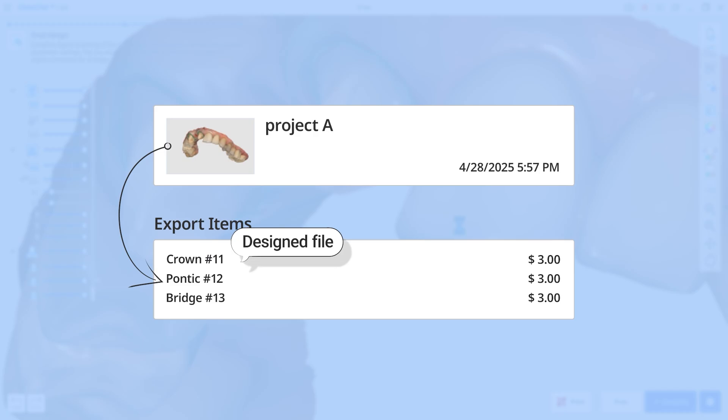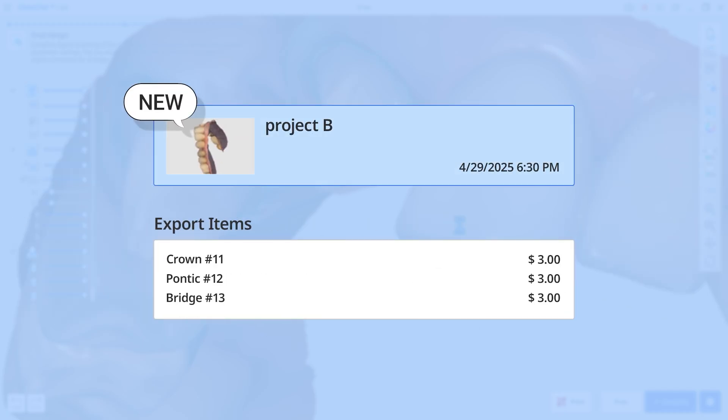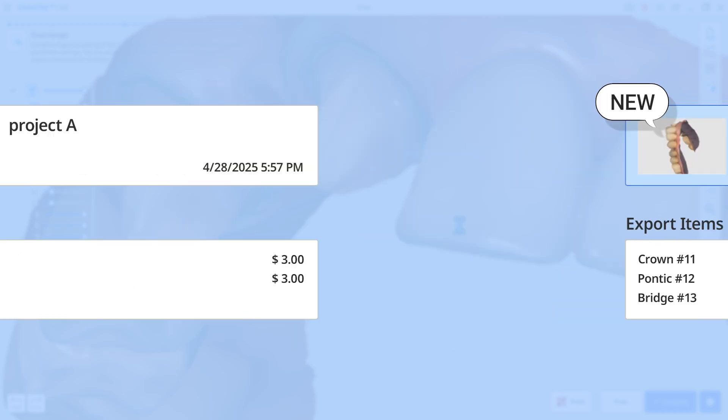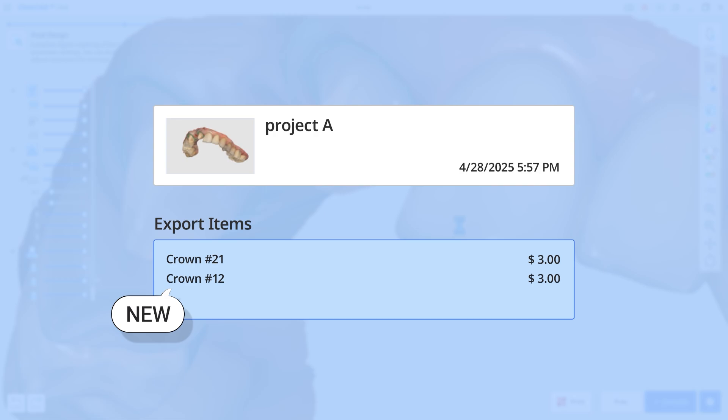Payment is valid only for the file from this project. Therefore, designing the same tooth in a new project still requires payment. Even within the same project, designing a different tooth or a different prosthesis for the same tooth is considered new and requires payment.